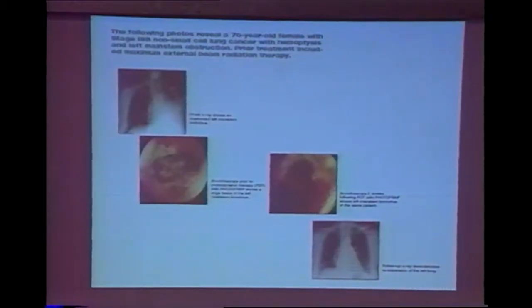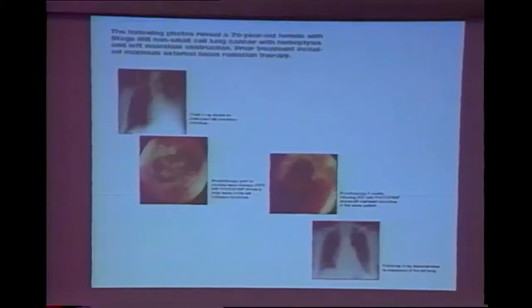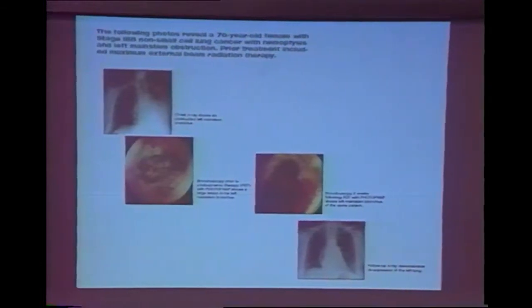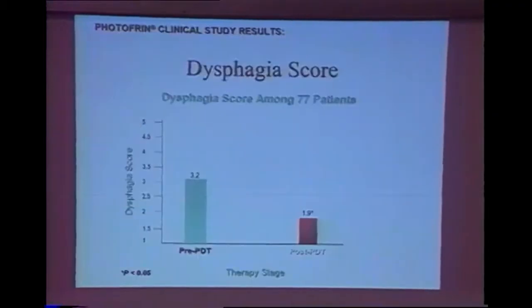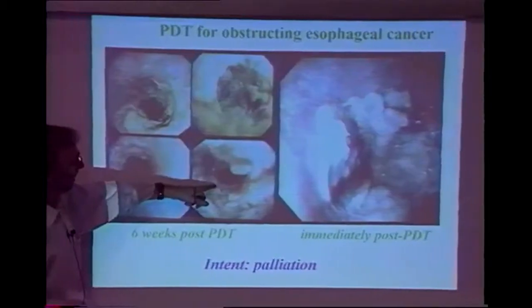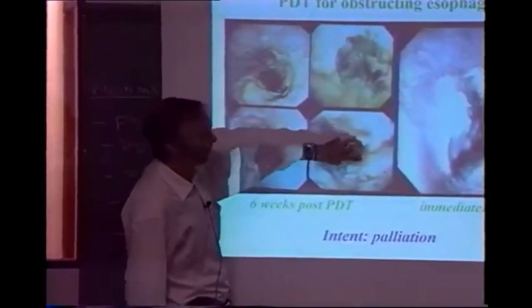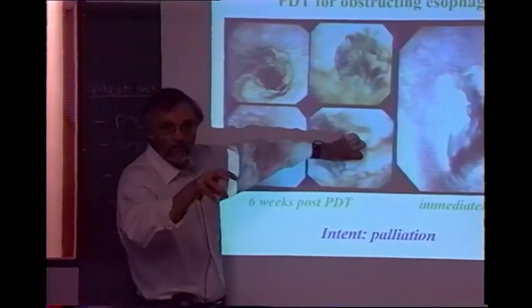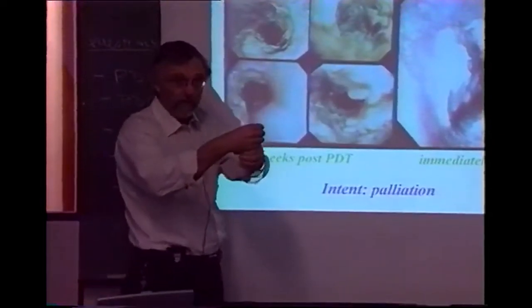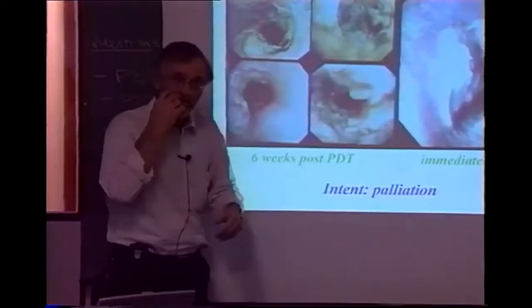Again, palliation. There is an interesting application using stents on glandular tissue. It's been a very important application. For example, in the esophagus, what people are talking about doing is once you've opened it up, you then put in a stent, which gives you the mechanical stability. The tumor keeps growing, but you can go in and keep killing it.